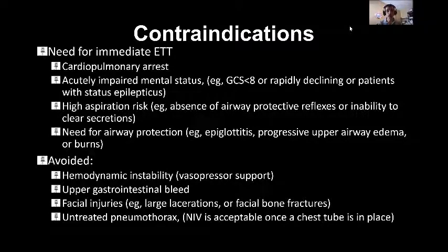We'll come to that, Hajar. We'll come to the types one by one. I just said the general, but we will come to the types one by one. And when we go to that, you will understand it. But in general, there are two types. There are continuous and there are bilevel in general. So this was a general overview. We will talk about each type.